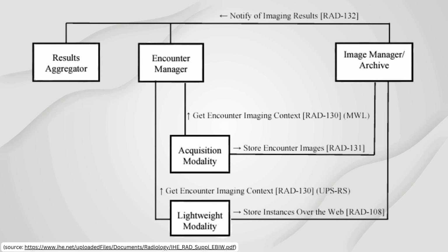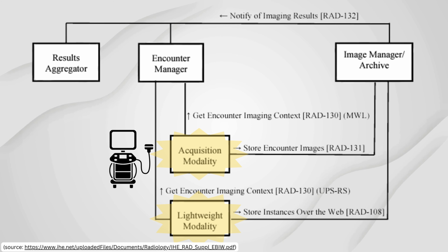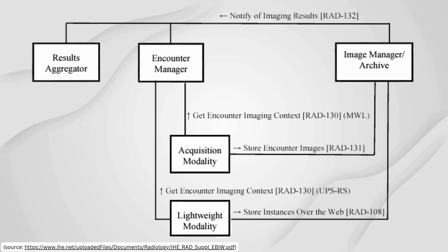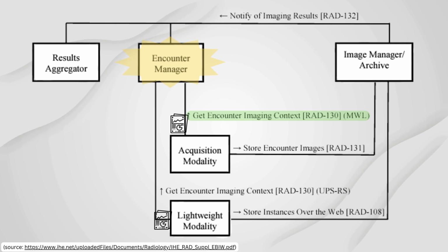We start at the point of acquisition, the acquisition modality or the lightweight modality, depending on the type of device. It is either a full-on acquisition modality like a point-of-care ultrasound that can acquire or construct the pixels themselves, or a lightweight modality which may import pixels and device metadata from a separate image capture device, for example, a digital camera. The modality can retrieve the encounter metadata and patient demographics from the encounter manager, either using the modality worklist or via UPS-RS.